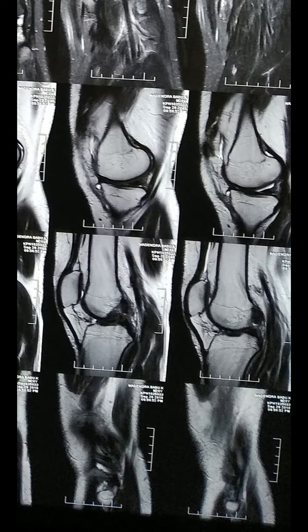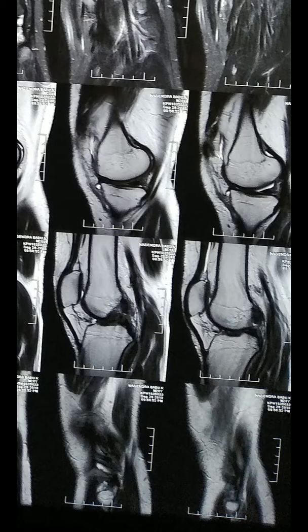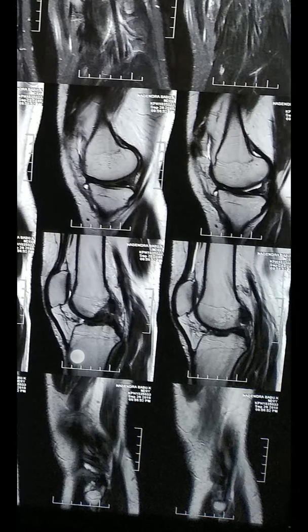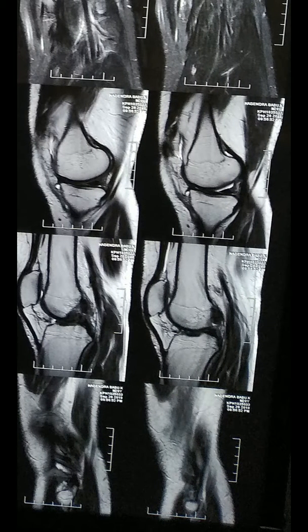Number one: discontinuity. Number two: abnormal orientation. Number three: abnormal signal. Normally ACL is low signal in T2 - that means it looks blackish in T2. Whereas in acute ACL tear, it's a high signal, meaning it looks more whitish - that is layman's language. Usually low signal in T2, in acute tear, high signal.